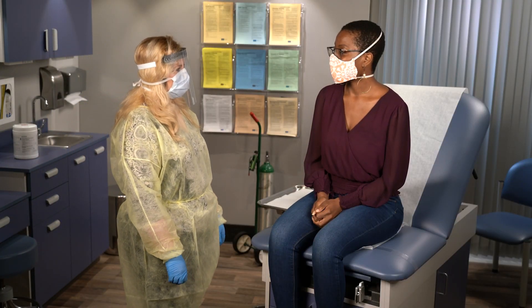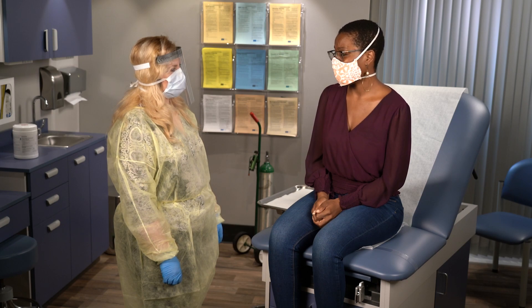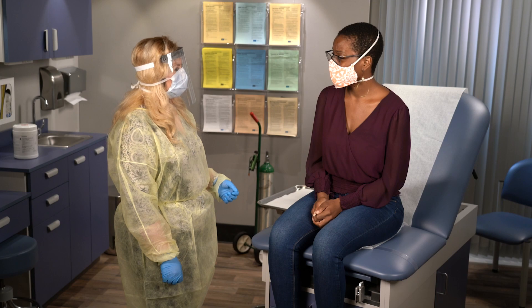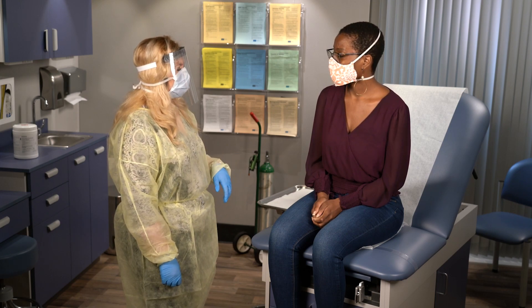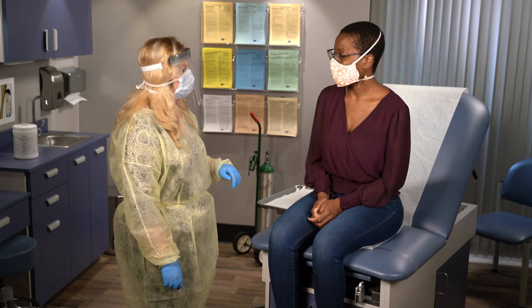Hi, what brings you in today? I've had a cough and my friend recently got tested positive for COVID-19. Are you having any trouble breathing? No. I'm going to check your oxygen levels because some people that have COVID-19, even if they're not having any trouble breathing, can have low oxygen levels. Okay.